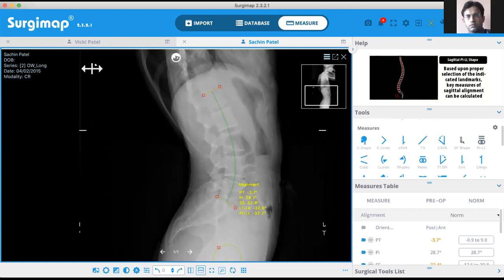Once I selected the PI-LL tool, it's giving me the two femoral heads. It's giving me 8 points actually. Two points for the first femoral head, where I start and where I end. Third point where I start the second femoral head, and fourth point where I end that circle. Fifth point, like Kshitij said, it was very useful even for me to look at the help. It was shown very clearly.